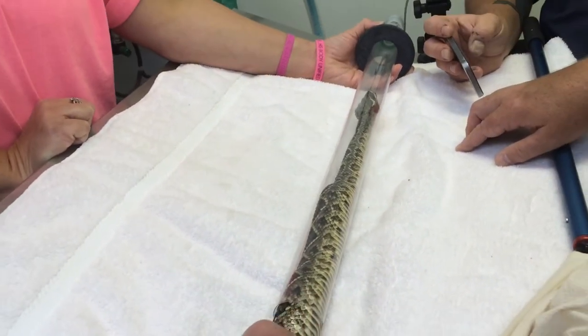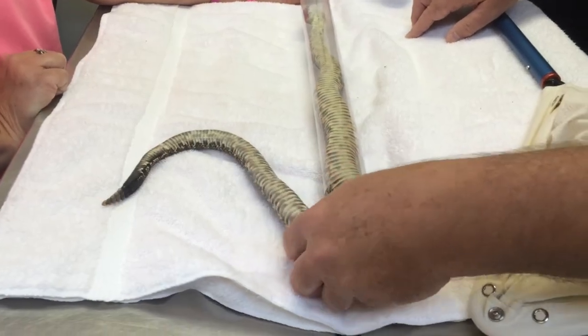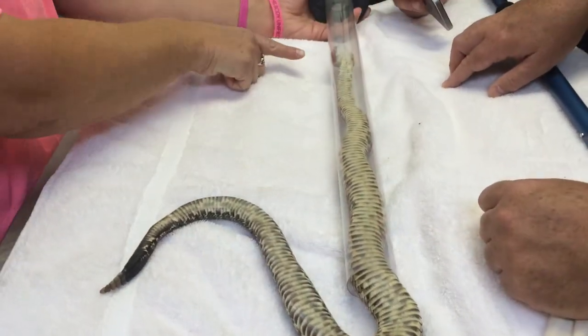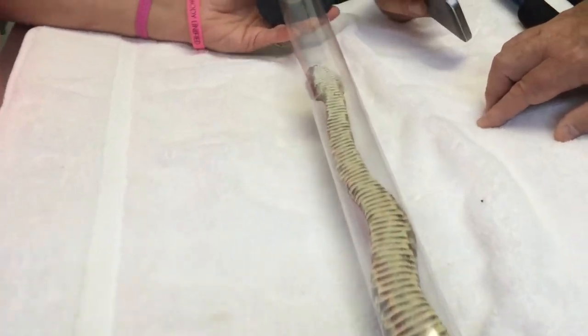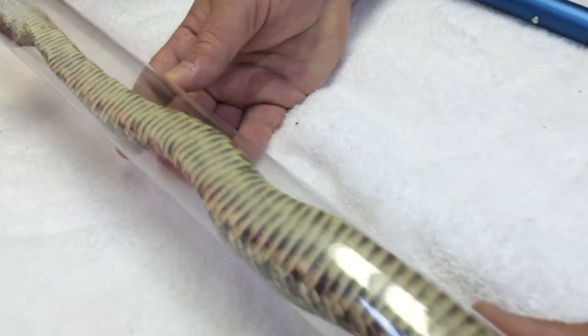The good news is our buddy is numb. One of the ways you can tell with snakes is the righting reflex. So we'll be doing oral surgery on a rattlesnake.